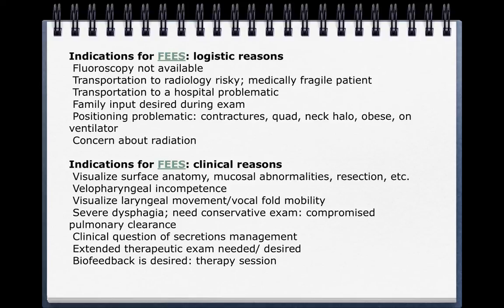There are also clinical reasons why you might want to have FEES. For example, you might want just to look at the surface anatomy. You might just want to look at a patient post-surgery for laryngeal cancer. They didn't have to take out that much tissue, but you would like to take a look at the tissue that's remained.